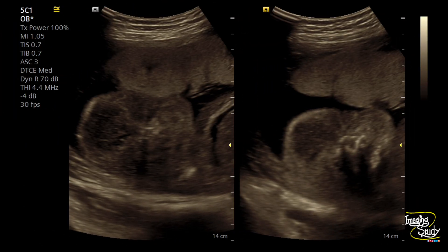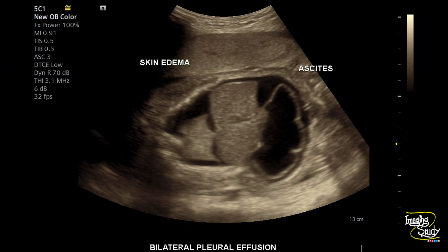Here you can see the fetal face in coronal section — it looks quite solemn, with edematous skin making a puffy face. In the thoracoabdominal region section, you can see the edematous skin, bilateral pleural effusion, flattened diaphragm, and compressed lungs. The liver is enlarged, which we will measure later. The abdomen is distended with ascitic fluid, and this is the peritoneal membrane floating within the ascitic fluid.